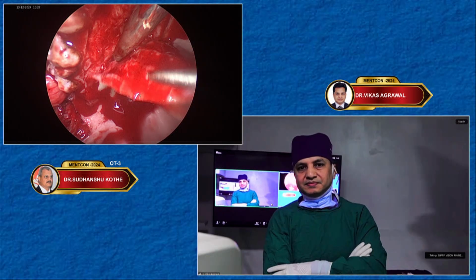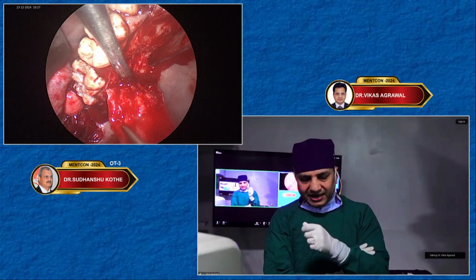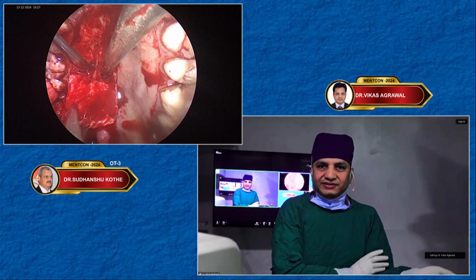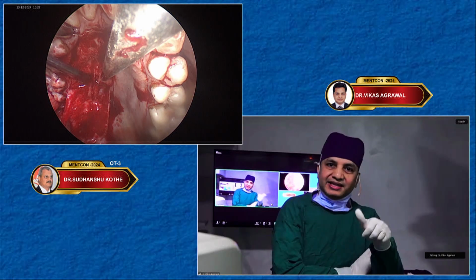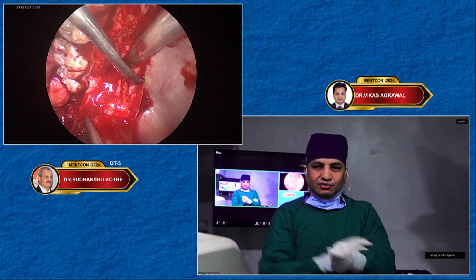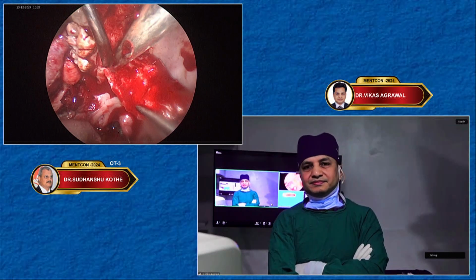And the healing time for both procedures? See, if you cauterize after doing debrider adenoidectomy, then the healing time will be a little more because you have cauterized. That is 350 degrees centigrade. This is 60 or 70 degrees centigrade. So obviously, healing time will remain the same, but the pain and the inflammation will be much less in coblation because of the temperature. If you have only cauterized a few twigs here and there, healing time will remain almost the same. There will be no difference.